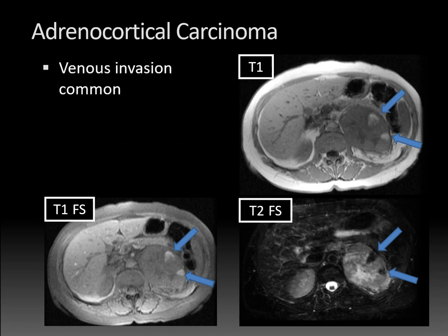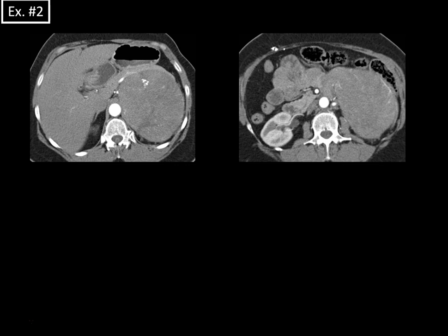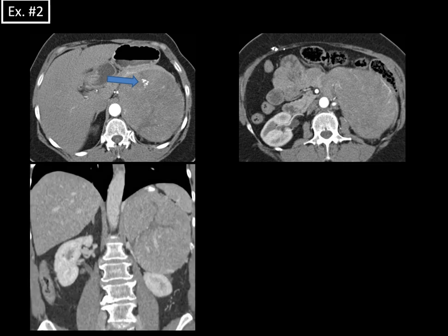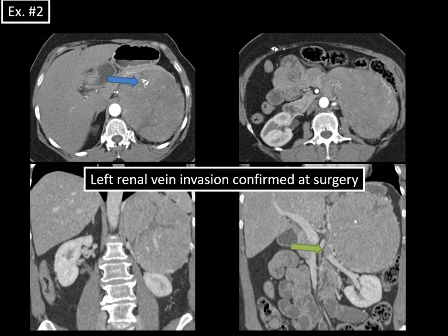Venous invasion is common with adrenocortical carcinoma. When there's metastatic disease, it tends to spread to lymph nodes, lung, bones, and liver. Here's another case — a large adrenocortical carcinoma on the left, very heterogeneous, with areas of calcification in the anterior aspect. The coronal image shows the underlying kidney displaced by the extremely large tumor, much larger than 6 centimeters. On the coronal image, there's a subtle area of left renal vein invasion, confirmed at surgery. Anytime you see an adrenal mass larger than 6 centimeters invading into the adjacent renal vein or inferior vena cava, that's extremely suspicious for adrenocortical carcinoma.